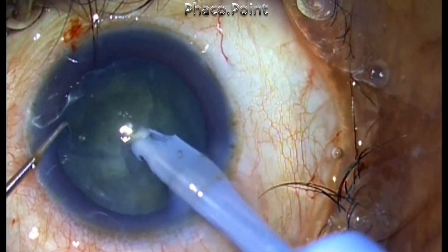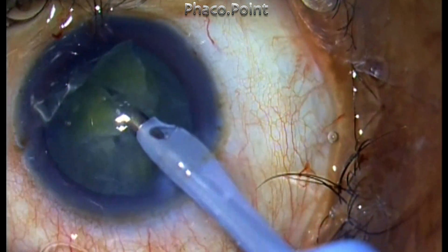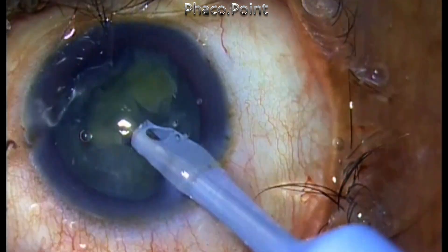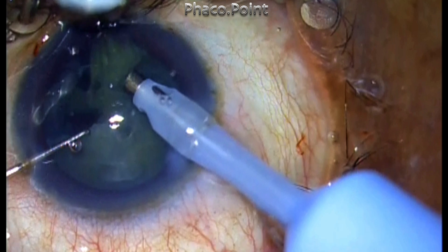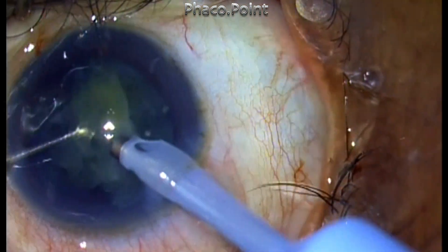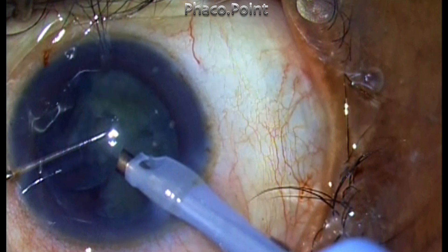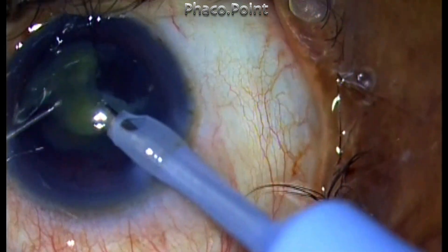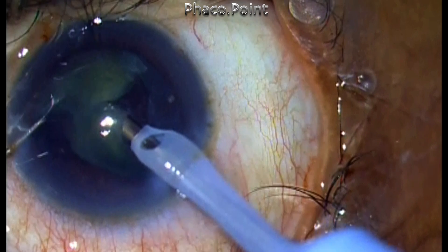This is what you're seeing in this patient. If the rhexis were slightly larger, nucleus piece followability would have been excellent. The sluggish followability is not due to different phaco settings — the settings are identical to what I normally use. The smaller rhexis is what causes difficulty in mobilization of nucleus fragments.